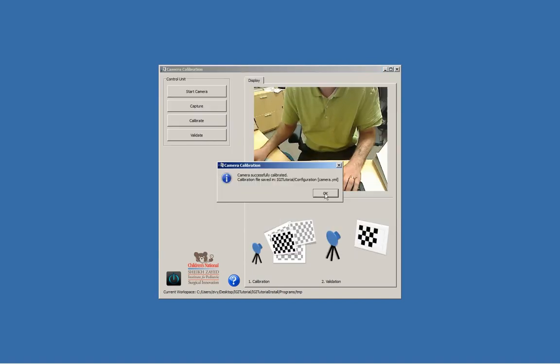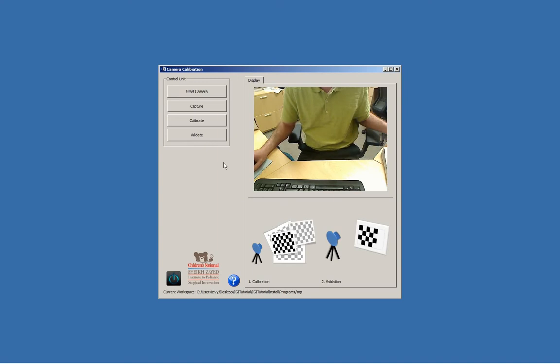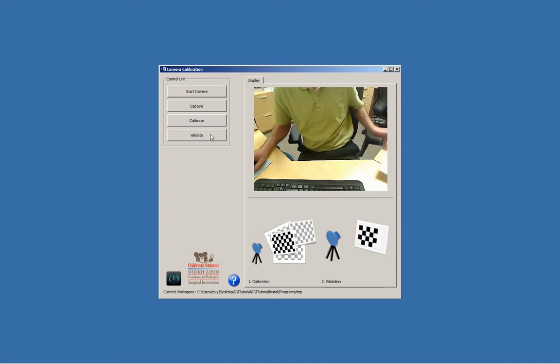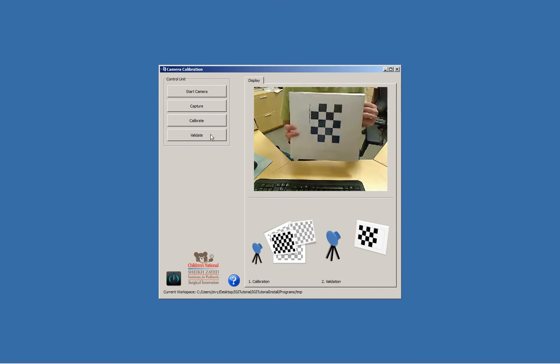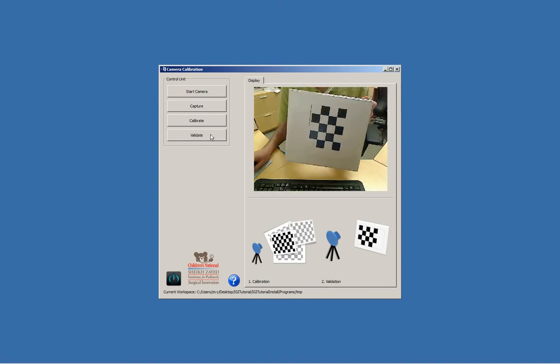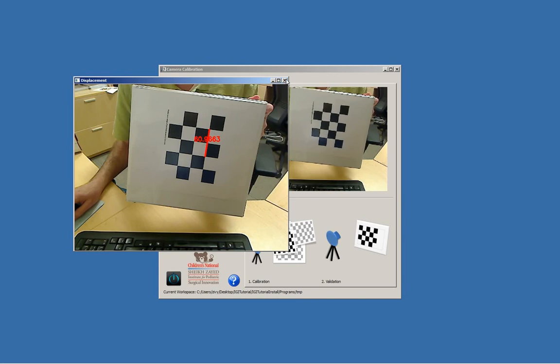The camera was calibrated successfully, and now to test that, we use a validation pattern. That's on the other side of the folder. What we expect is that this distance is about 60 millimeters, if you printed it at the correct size.